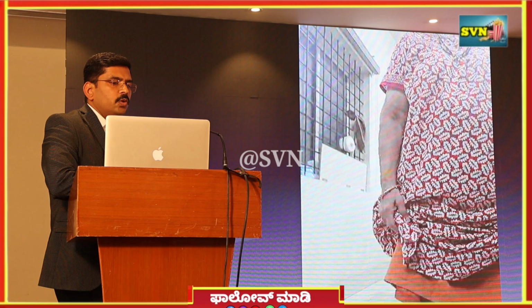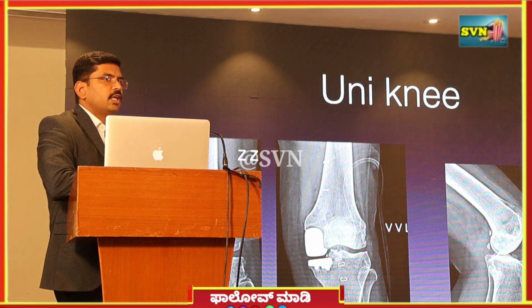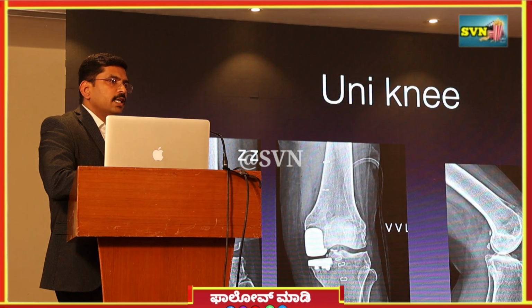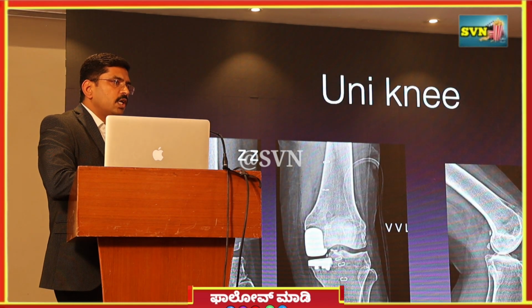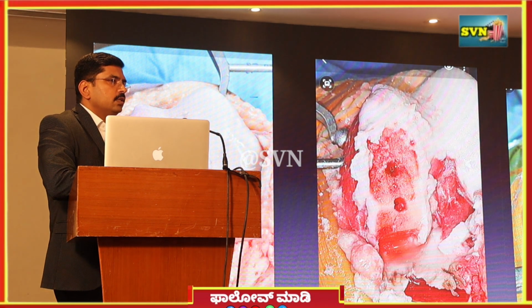And since we have a robo, there is no specific need that the complete knee has to be replaced. Now we have come up with the uni knee, where only the damaged part of the knee is replaced, and the rest which is normal is kept. It is called uni knee. Only the part which is damaged is replaced, and the part which is healthy is left intact.